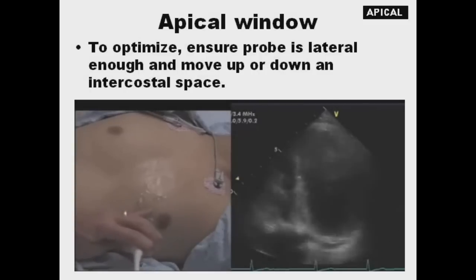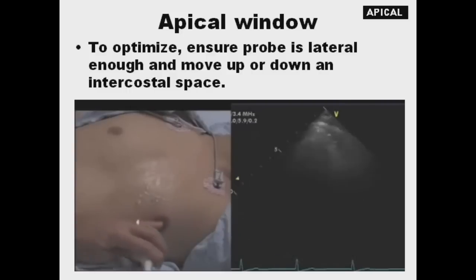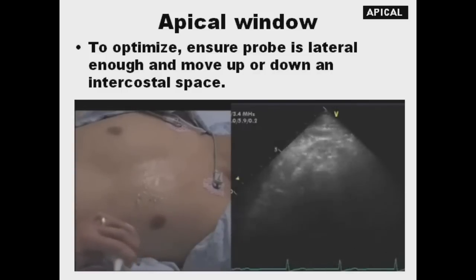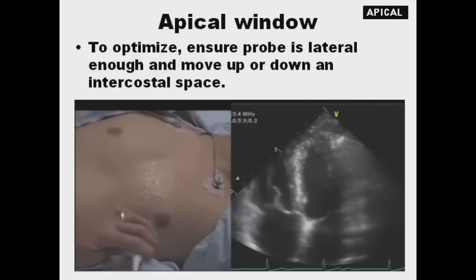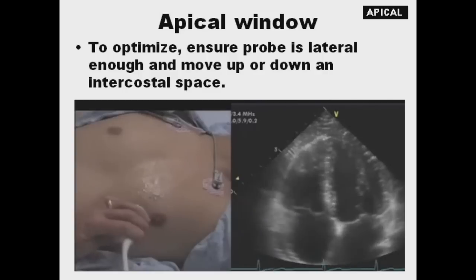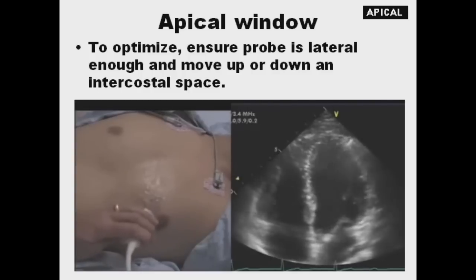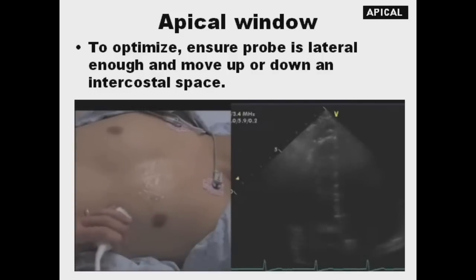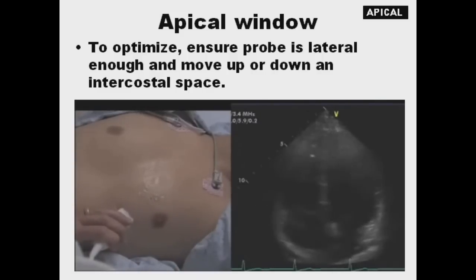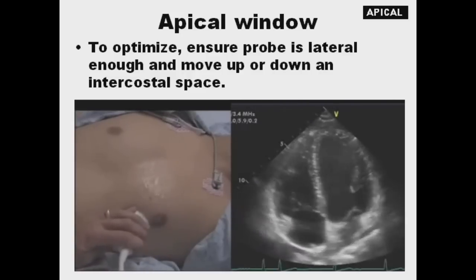To make the circle smaller in the area where I'm closing in on it, and if I pass, I can just back up on the circle and then I can fall back into my view. So again, by circling around, see how big the movements are, very gross with my hand, and you can see what's changing on the screen as well. Just back up a little bit after I've passed something that's bright and then go into the nicer view, and now I can make my more minute manipulations to fine-tune an image. But it's very easy to end up in a place where you're working, and it's not a good window, and if you just take a little circle survey or go window shopping, you may stumble into a better view.